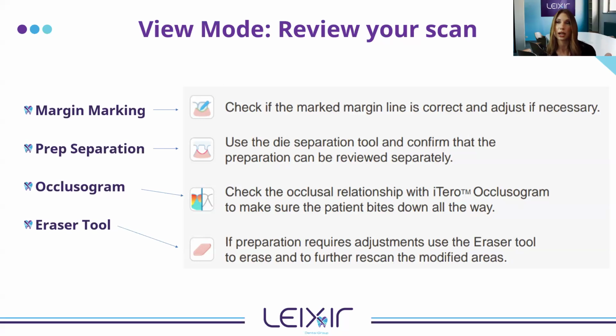So if you can simply check this for us before you send it, it is really helpful because we can't adjust this on our end. We either have to send it back to you to adjust, do our best with the scan, or send it to iTero modeling, which can delay the case a little bit. Okay. You also have your occlusogram, so checking your occlusal clearance, making sure there's enough clearance for the material that you selected.